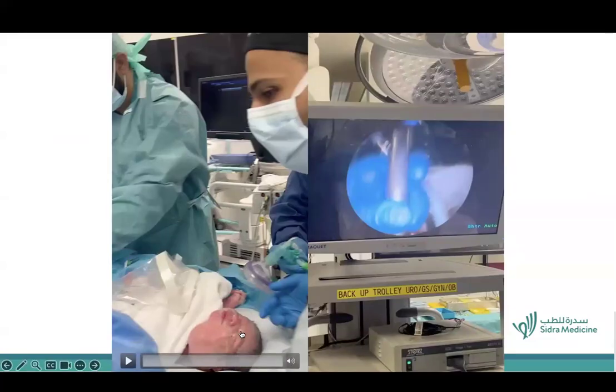As you can see with this baby, there was a large mass essentially obstructing the airway, and this was picked up in utero. We planned for essentially a delivery or an intubation just after the delivery. So the mother had an emergency cesarean section just opposite where I was set up with my airway equipment, and then the baby was brought to our operating room where the anesthesiologist and I were planning the airway securement.